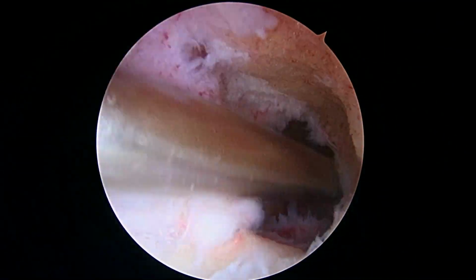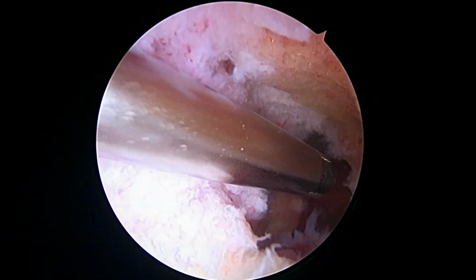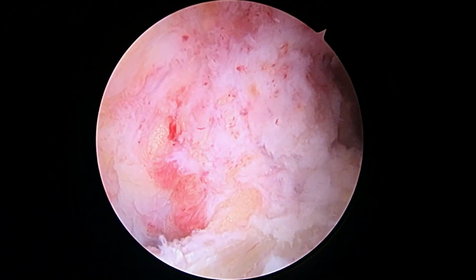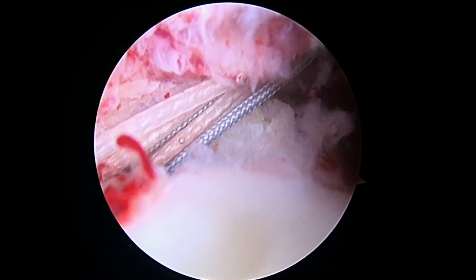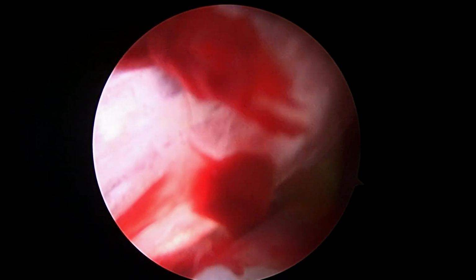Okay, so this is where we're going to put our size 10 millimeter graft. And we're just going to get ready to make some tibial and femoral tunnels here. But it looks like we're going to have a nice shot to get this done for you. Okay, here's a pause. Okay, so we're going to pull the striped suture. And you can see how that's going to bring the graft into position.